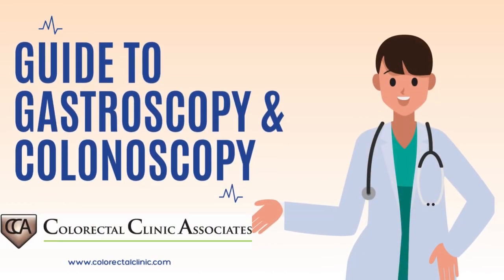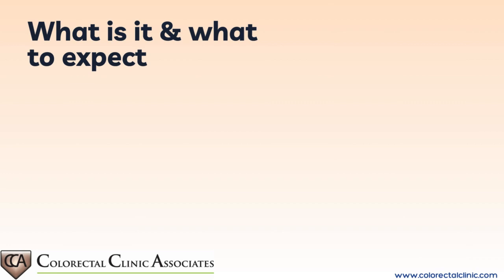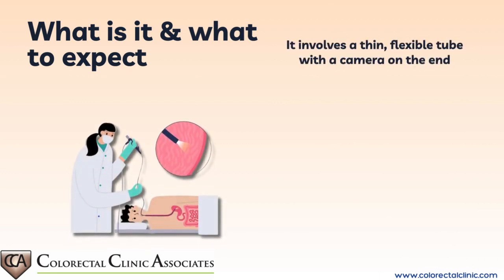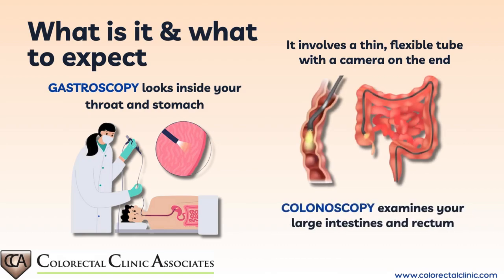Welcome to your guide to gastroscopy and colonoscopy. Both gastroscopy and colonoscopy are different types of endoscopy. It involves a thin, flexible tube with a camera on the end that helps the doctor see inside your body to investigate symptoms and reach a diagnosis. A gastroscopy looks inside your throat and stomach, while a colonoscopy examines your large intestines and rectum.